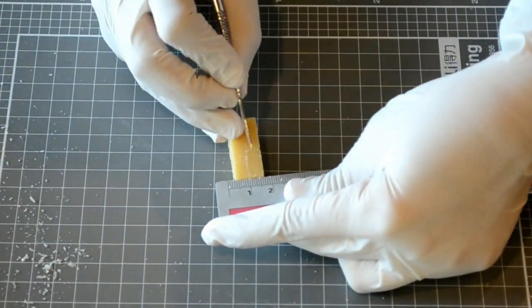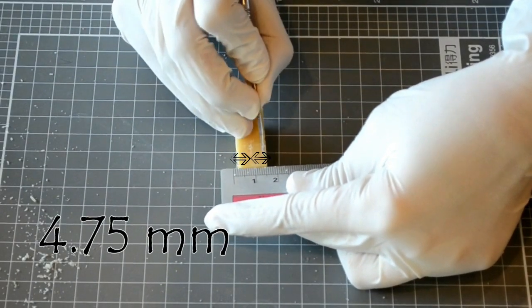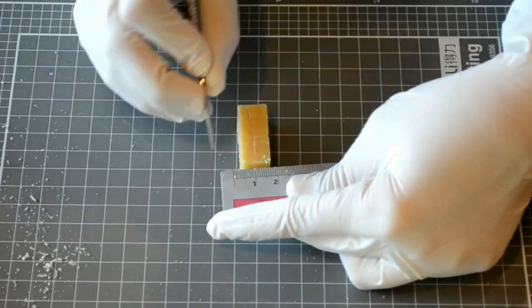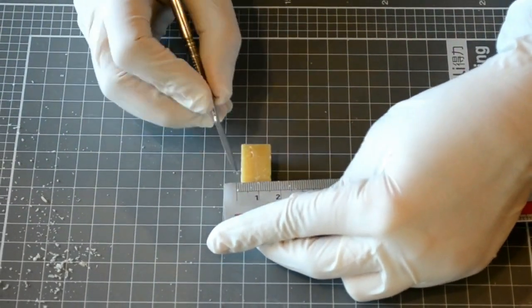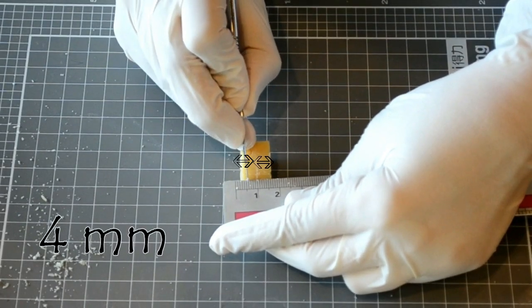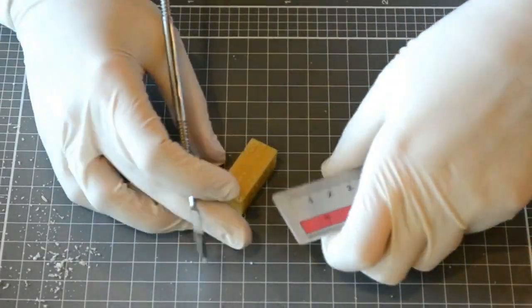For the mesiodistal dimension of the crown, mark 4.75 millimeters on each side of the central line at the incisal edge. This adds up to 9.5 millimeters. The mesiodistal dimension of the crown at the cervical portion is 8 millimeters. Carve this by following the previously mentioned technique and plot 4 millimeters on each side of the vertical line.